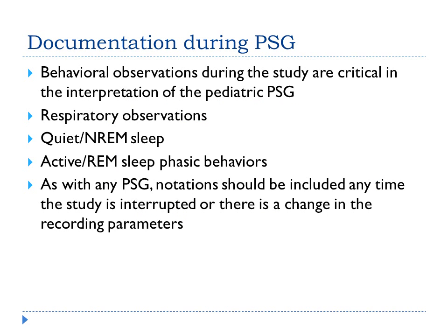Documentation during a PSG, I cannot stress how important this is, especially with our pediatric group. Behavioral observations during the study are critical in the interpretation of the pediatric PSG, so you want to make sure you document all behaviors: sucking thumbs, wiggling toes, rocking head, whatever it may be. Also, respiratory observations. If you see that they're doing some belly breathing, or if it looks like you're seeing increased accessory muscle use while they're sleeping, make sure you're documenting that. Quiet and non-REM sleep, active REM sleep, phasic behaviors. You want to document those as they appear.